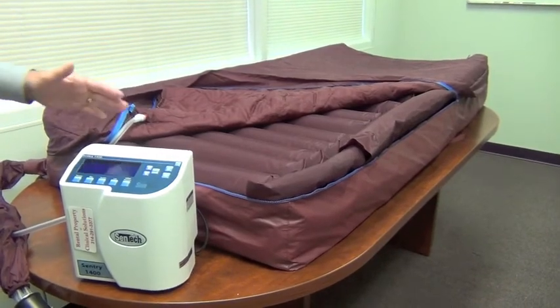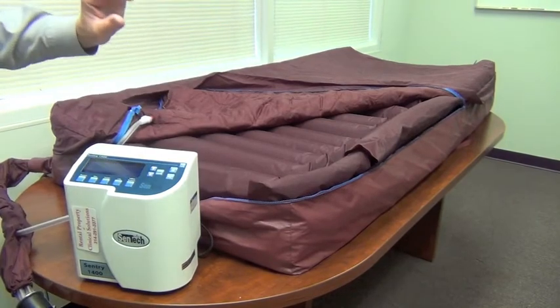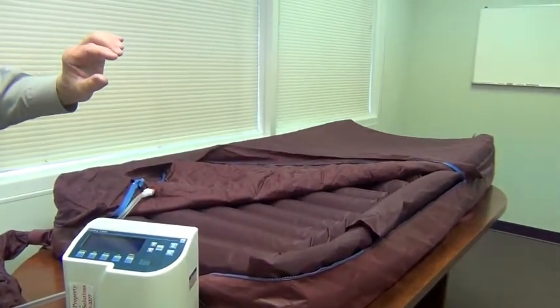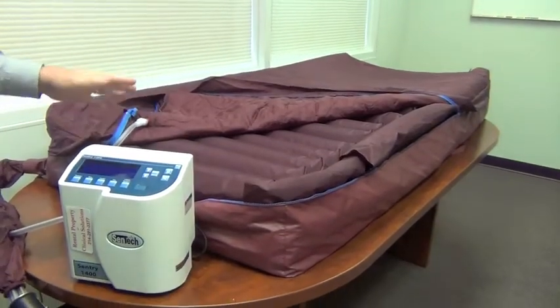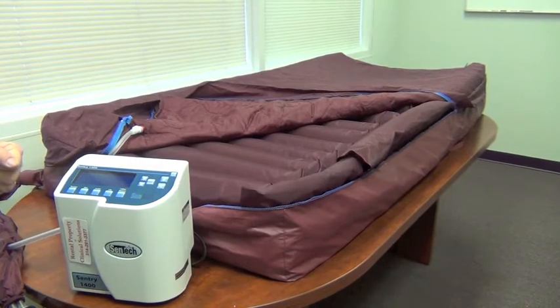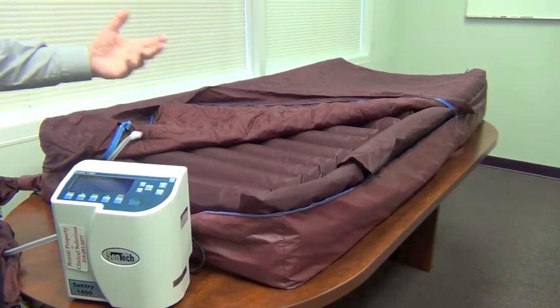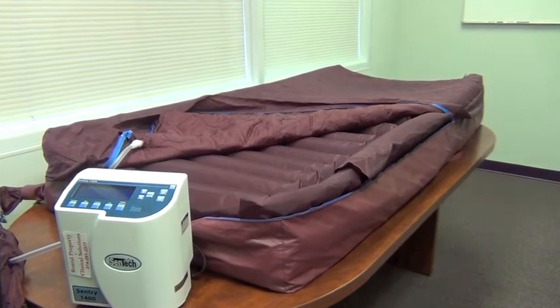So we're that much closer to the ground, and in the base of the mattress is a nylon covered piece of foam, which gives this system the property of a stretcher or a gurney. So it's not therapeutic, but it's not uncomfortable either, and it's adequate for padding when you're doing a transfer.